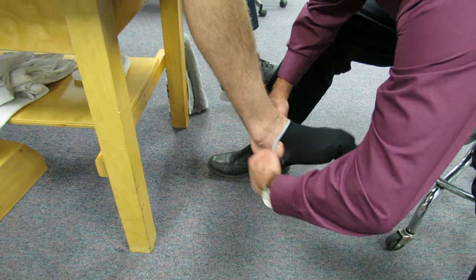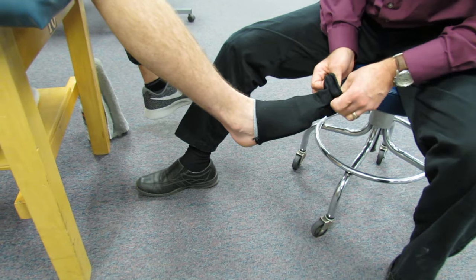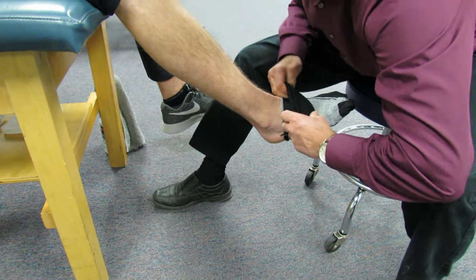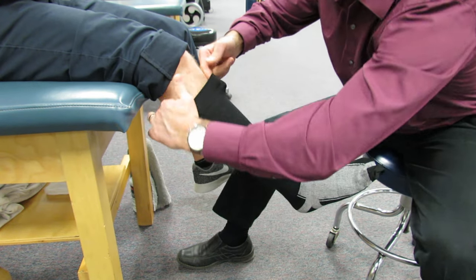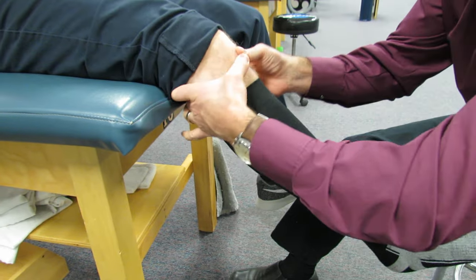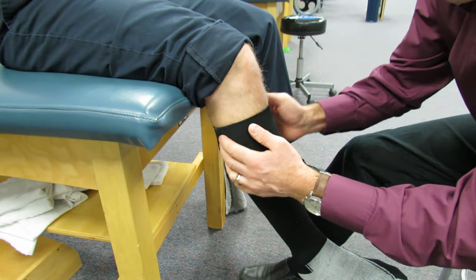Getting past the heel is the hardest part when putting on a compression sock. Once you get it to that point, you can take the top of the sock, bring it through, and pull it up like this, taking it right up there. Make sure that the top of the sock is never up past the knee joint — past the crook of the knee — and it's up nice and smooth like this.